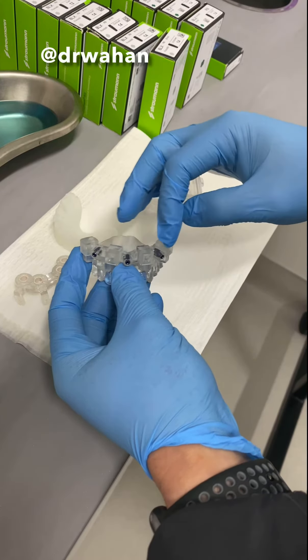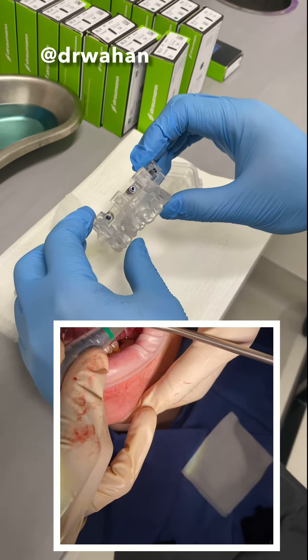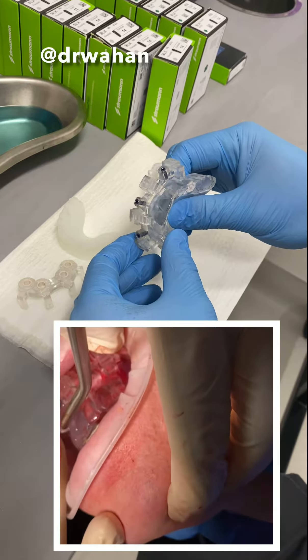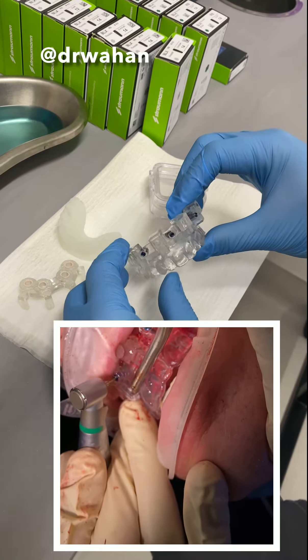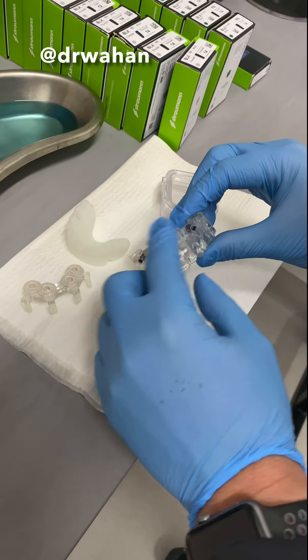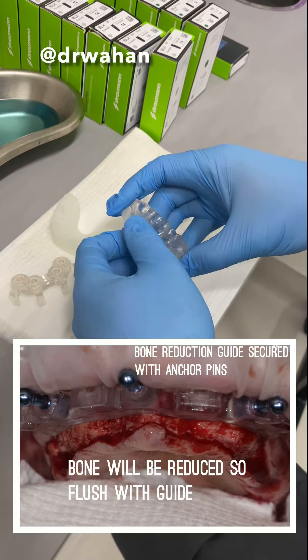So then Dr. Wohan will raise his flap on the buccal, put this on, and the flap will be reflected. This will seat positively on the palate. The patient will bite down. You'll drill and place the three anchor pin holes, remove these little connecting pins, and then this fixation guide is done.